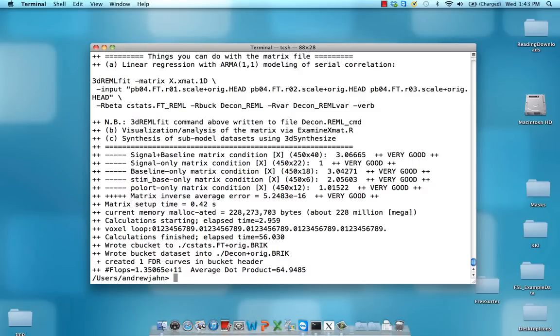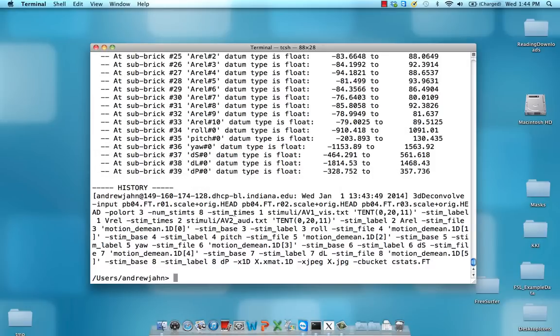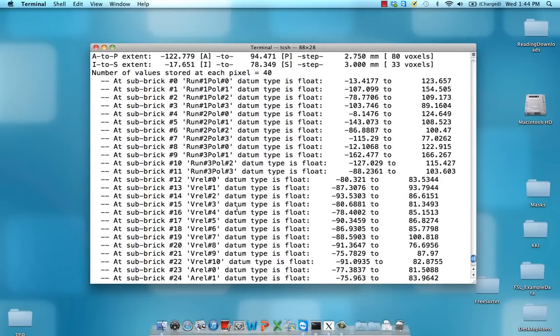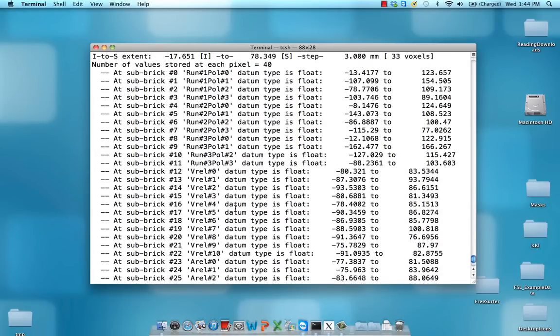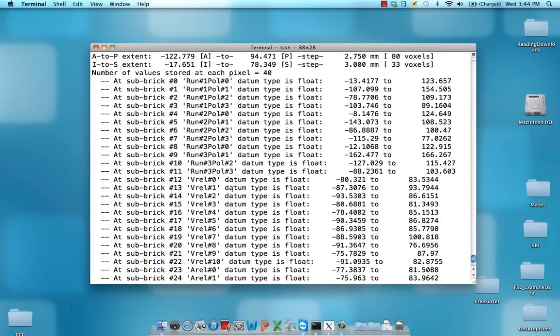Notice everything has been written into this C bucket dataset C stats. I'm going to extract certain things here. I'm just going to show you what's in there first of all.